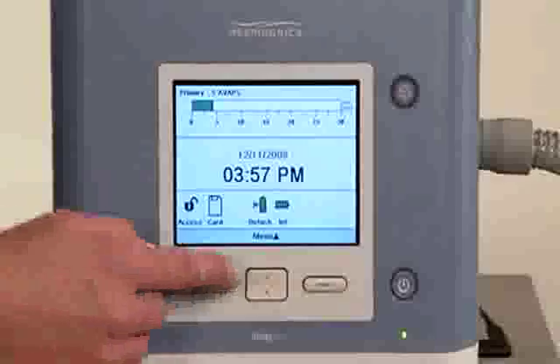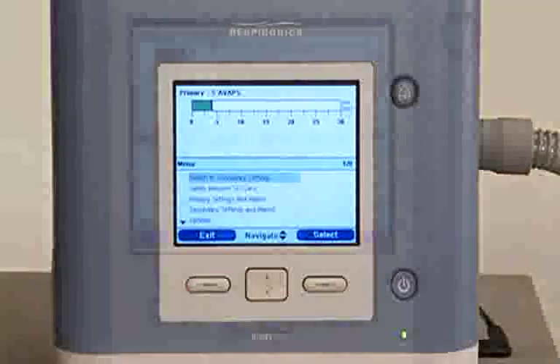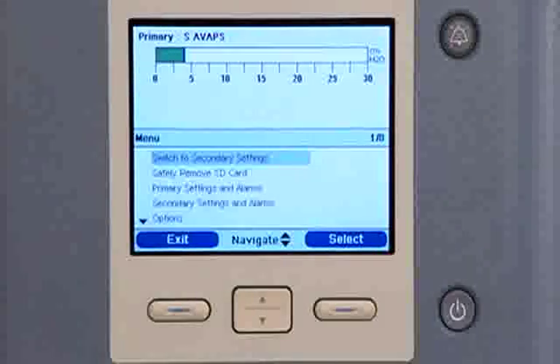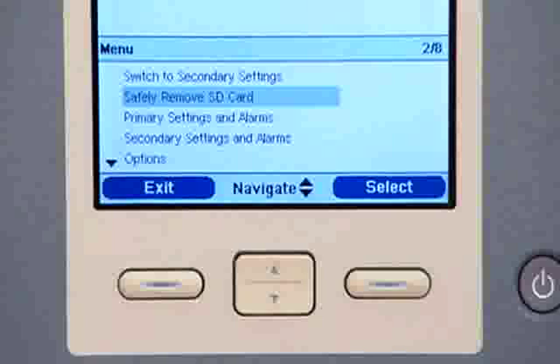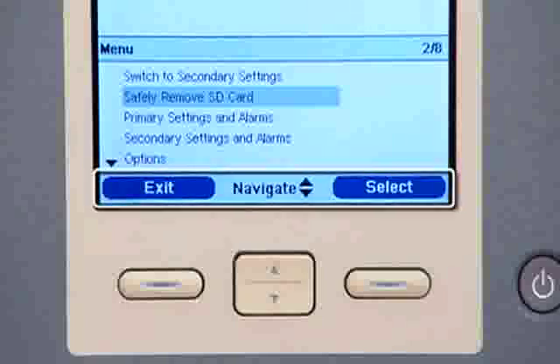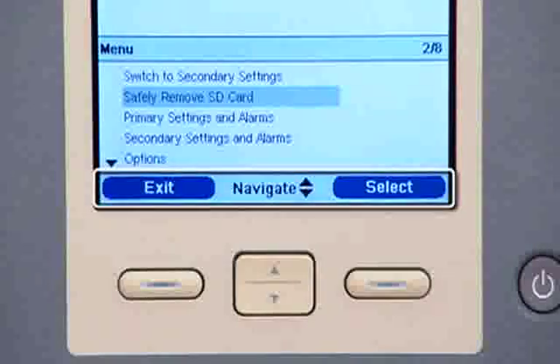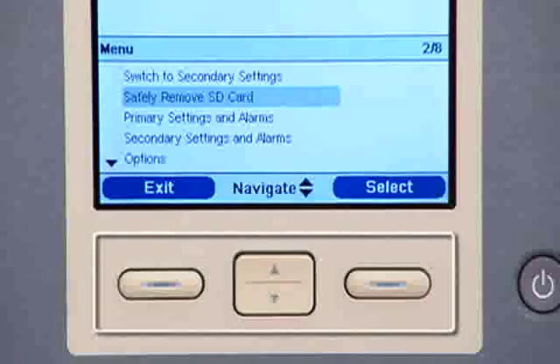Menu settings allow you to make some choices about Trilogy 100. To enter the menu screens from the monitor screen, press the up button on the ventilator. Menu options appear on the lower half of the display screen. At the bottom of the display screen is an on-screen button panel. These buttons correspond to the control buttons on the ventilator and can be used to navigate and select menu settings.